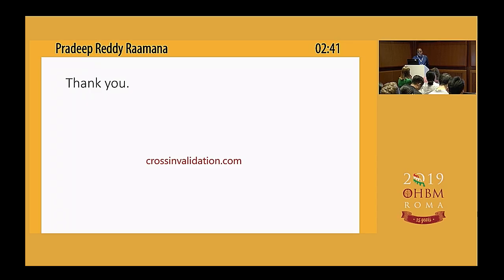No, I think I mentioned that sometimes it could be a problem, but depending on the location and the severity of the artifact, it may not be. Like the one example I showed you, I would believe that that would be useful for FreeSurfer analyses, or some manual morphometric analyses. So I didn't mean to say if you have an image with susceptibility artifact, you should exclude it. Sometimes you need to, depending on the location.